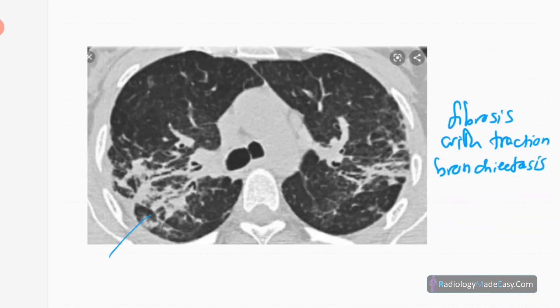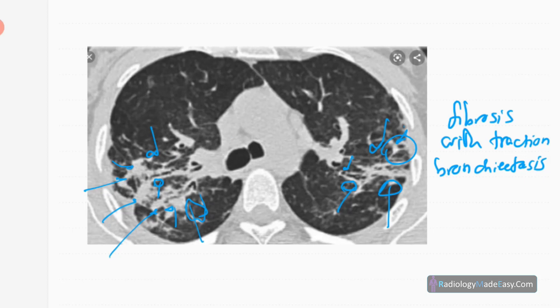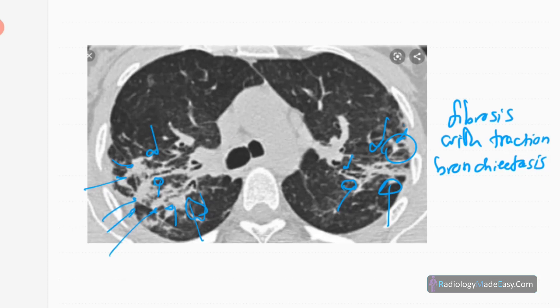This is fibrosis in post-primary TB on CT. You can see multiple fibrotic bands with dilated bronchi — this is called traction bronchiectasis. Traction bronchiectasis and fibrotic areas are clearly visible, along with pleural thickening.